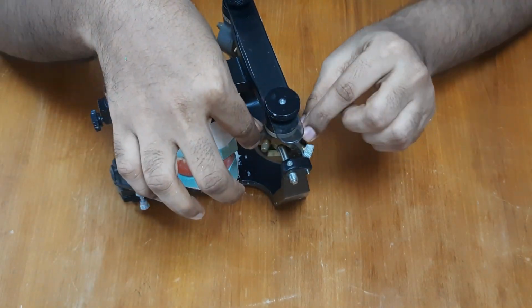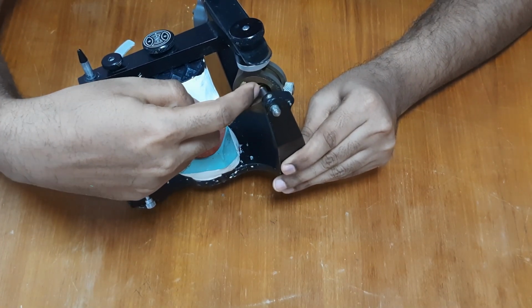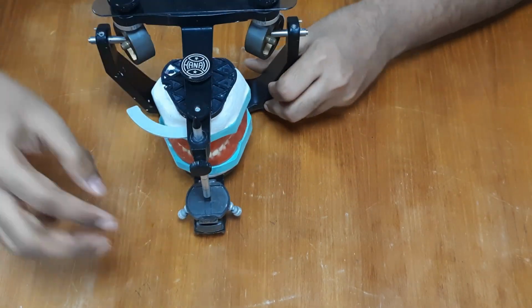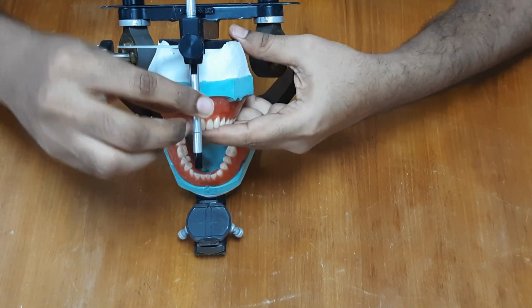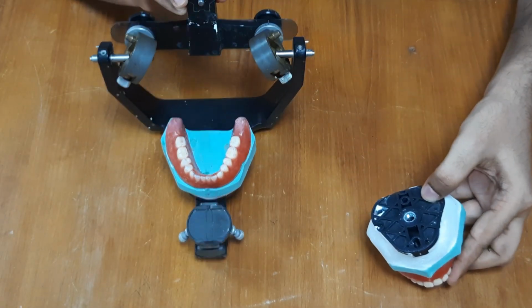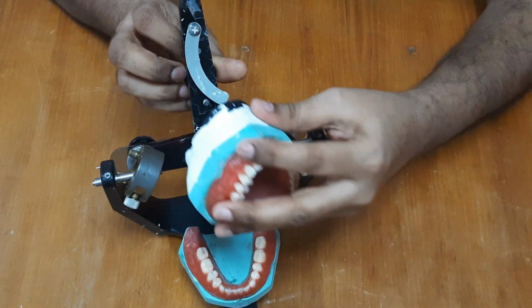The condylar guidance is attached to the upper member. In the center of the anterior-posterior arm, there is a dowel. This is used to attach the mounting plates.